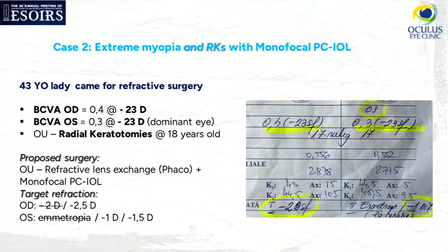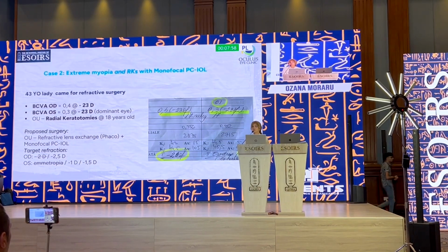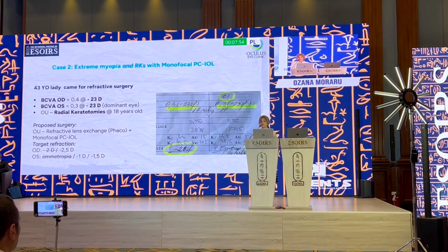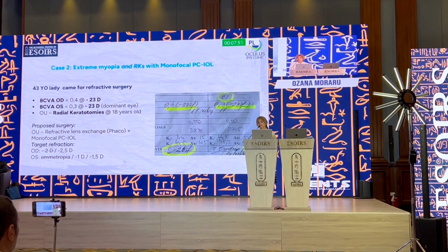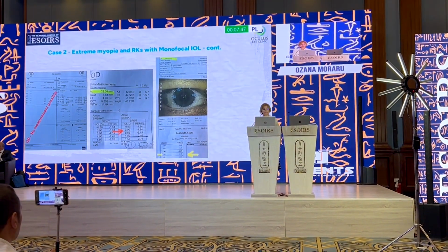Let's see how we did the biometry in extreme myopia with radial keratotomies. This lady with -23 came to us for the same refractive purposes, and we did the refractive lens exchange in both eyes. Initially she wanted to get rid completely of glasses, to be emmetropic. We managed to convince her that it's better to remain a bit myopic, and we targeted -1 for the dominant eye and -2 for the non-dominant, a sort of compromise.